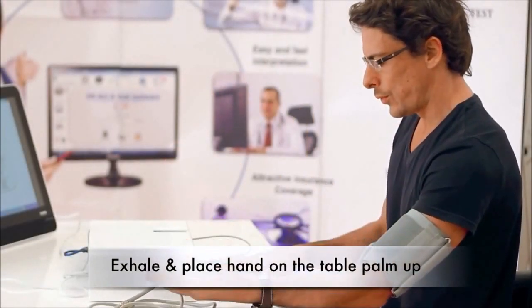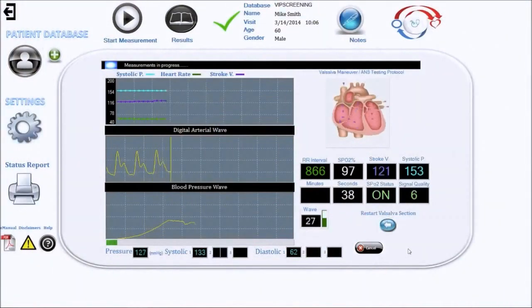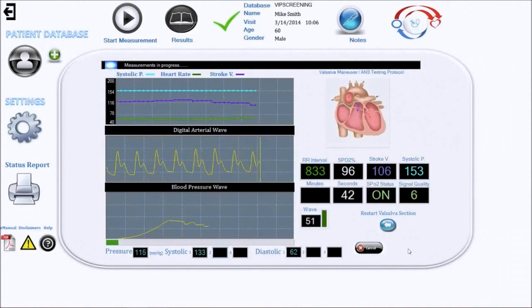Place the left arm back on the table with palm up. The patient's blood pressure is taken again. The software analyzes the sympathetic and parasympathetic responses during the Valsalva maneuver.